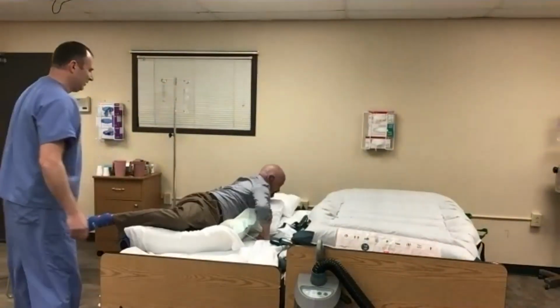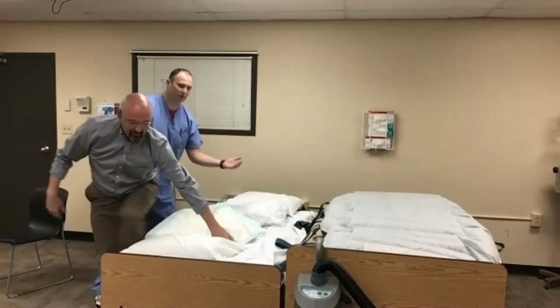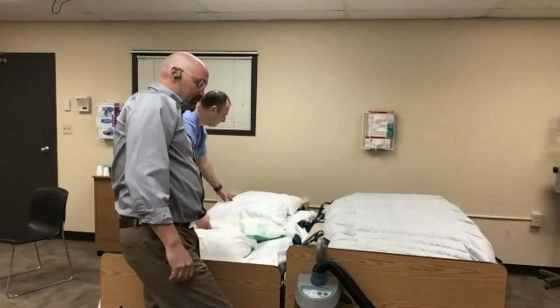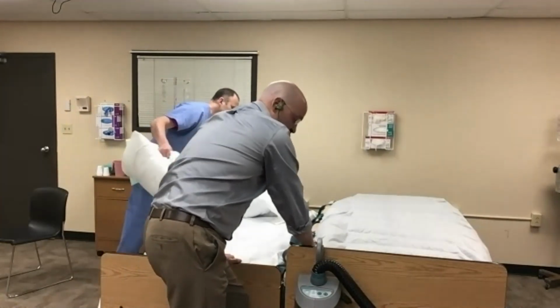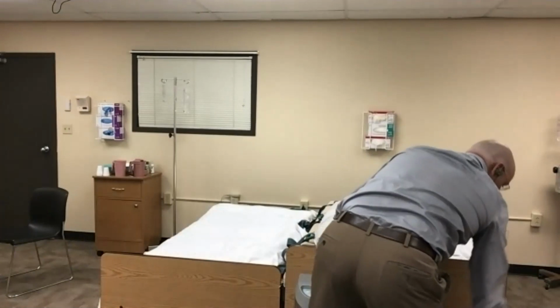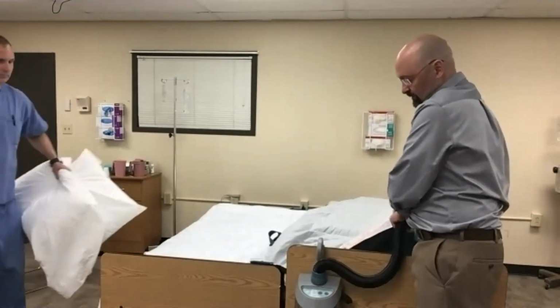So you can see how quickly that happens, and obviously there will be people here to collect. Absolutely, Christopher. So as we're doing this, trying to get that patient, especially larger patients, prone into that same space, a second surface is highly, highly, highly recommended.